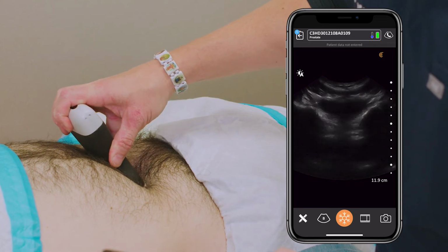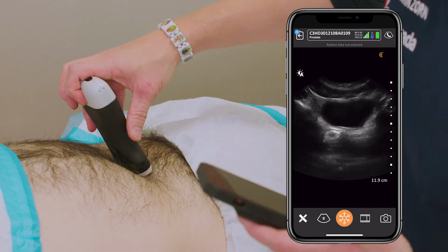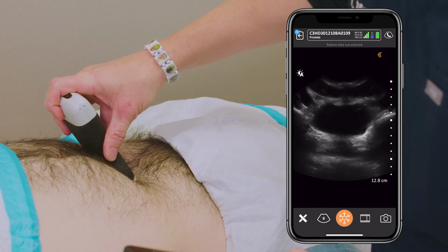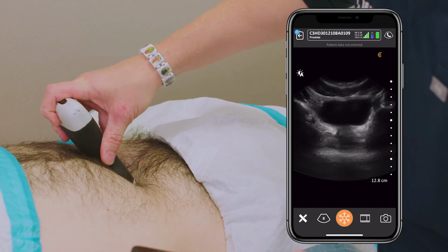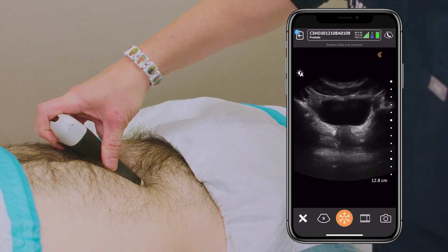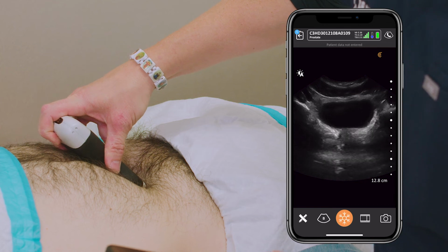So this is where I'll depress down on the belly. If certain patients are more obese, we'll ask them to lift up their pannus so that it flattens the area. I usually want to push downward and cephalad toward the head and then get underneath the pubic bone to avoid the ultrasound being bounced off the pubic bone, which can get in the way for a view of the apex. So here we go, clearly small prostate.